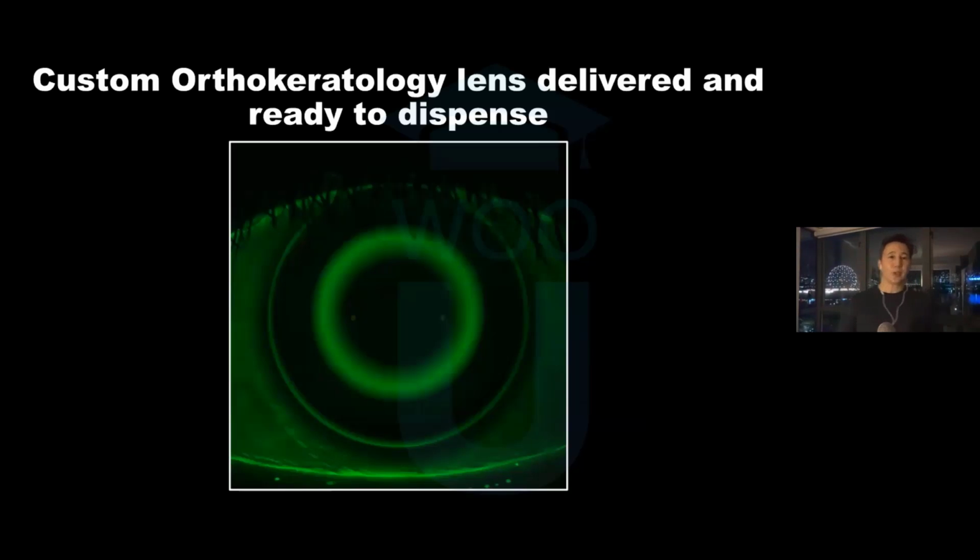Now, once you've got your custom orthokeratology lens, once that Wave lens arrives in the office, you put it on eye and you're ready to dispense, then that's when, for me, the whole mystery of Ortho-K begins to unravel. Things become pretty clear. What I mean by that is an Ortho-K lens in the open eye is absolutely not predictive of what it's going to do in the closed eye.